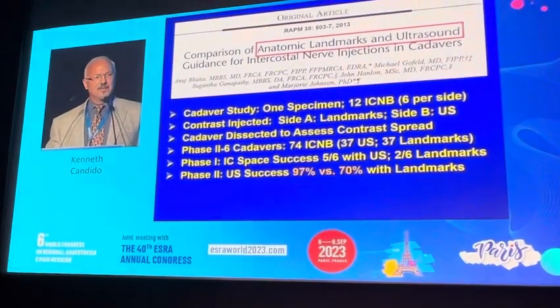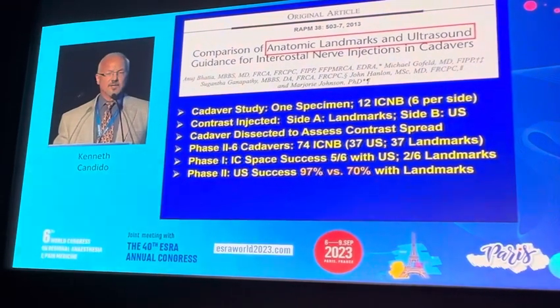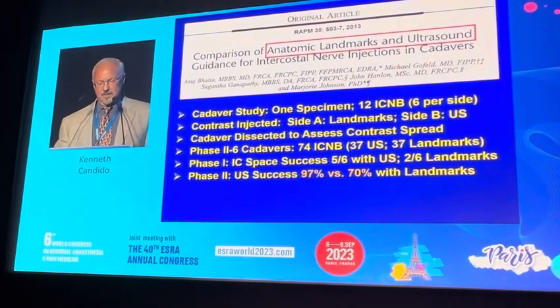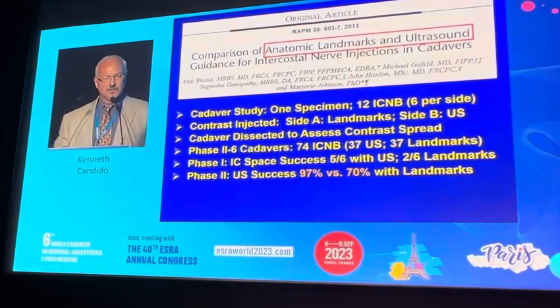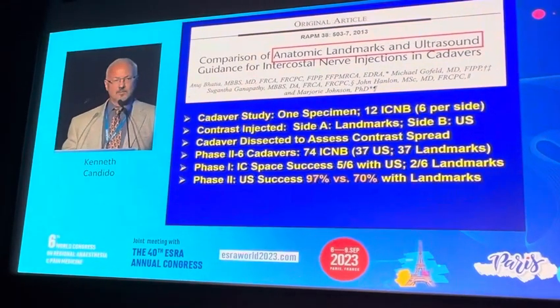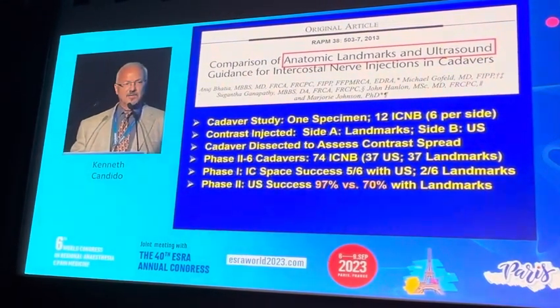But is there any data to suggest the superiority of ultrasonography versus fluoroscopy? And the answer, once again, is no. And that's true in cadaver studies. This is a nice paper from Michael Gofeld and Associates, which showed that although contrast was identified to be more successfully placed with ultrasonography, in clinical scenarios, this has not been borne out.